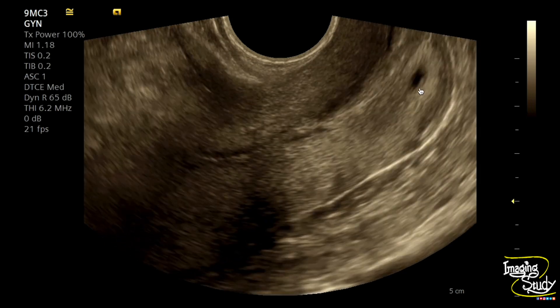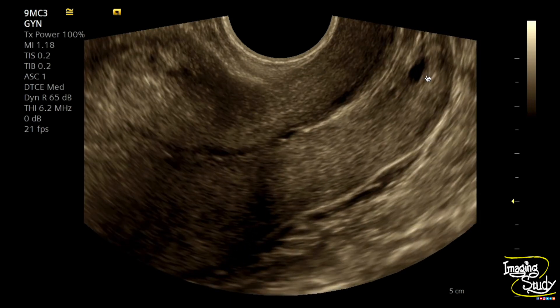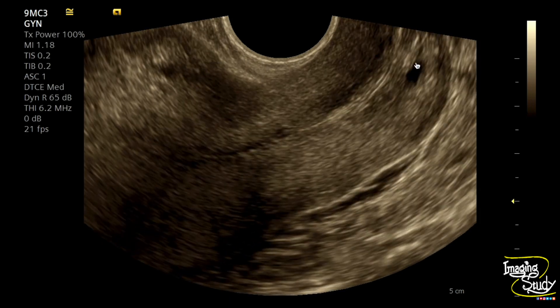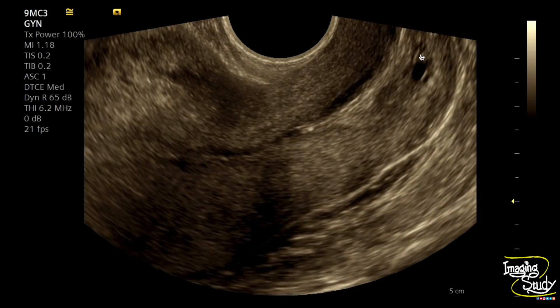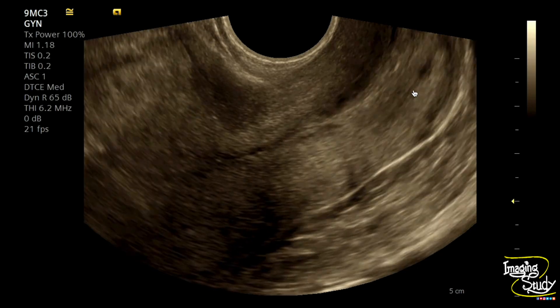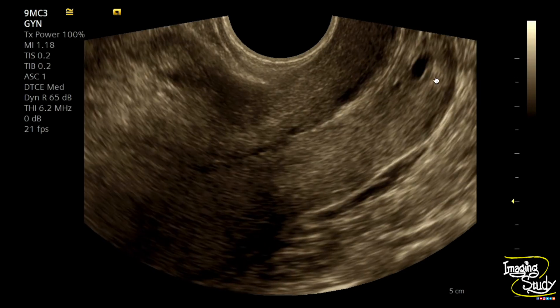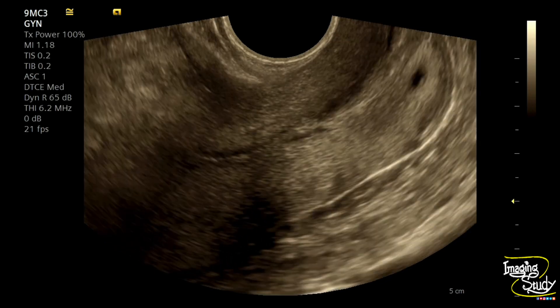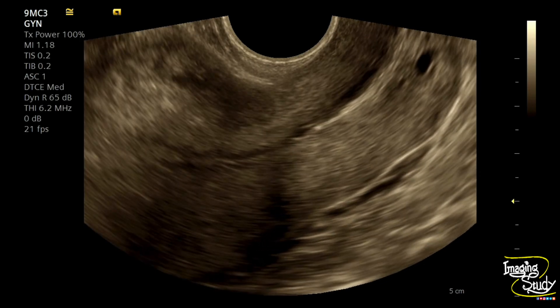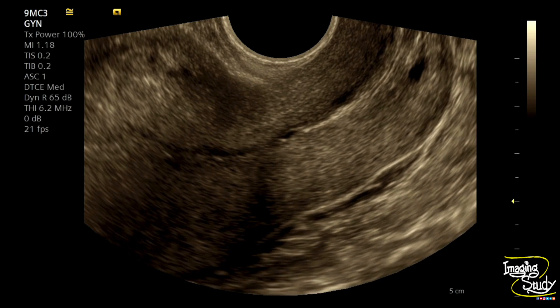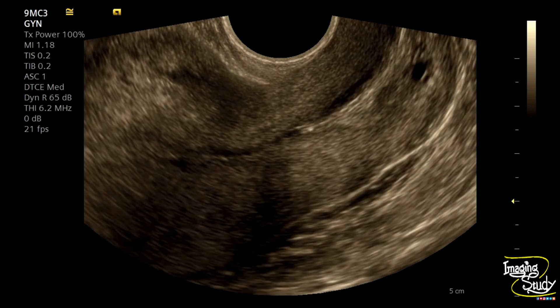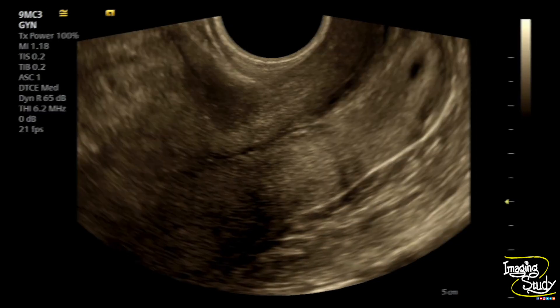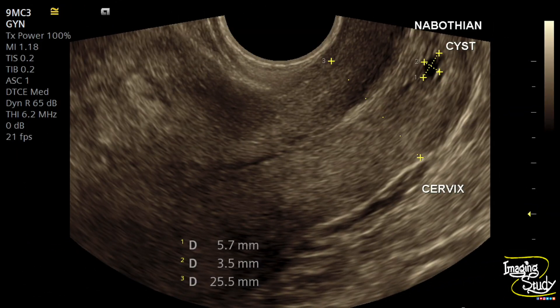You can see a tiny anechoic, well-defined area at the posterior cervical myometrium. This structure is the Nabothian cyst — this is a very common finding when you are doing transvaginal ultrasound. Here's the measurement of this Nabothian cyst.